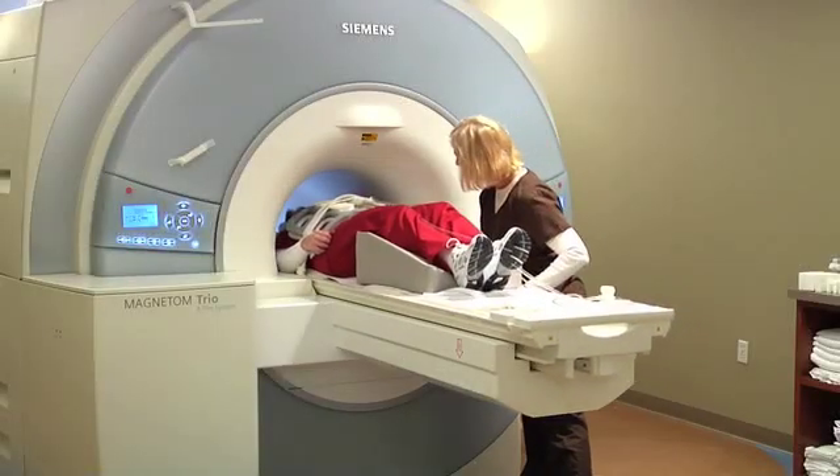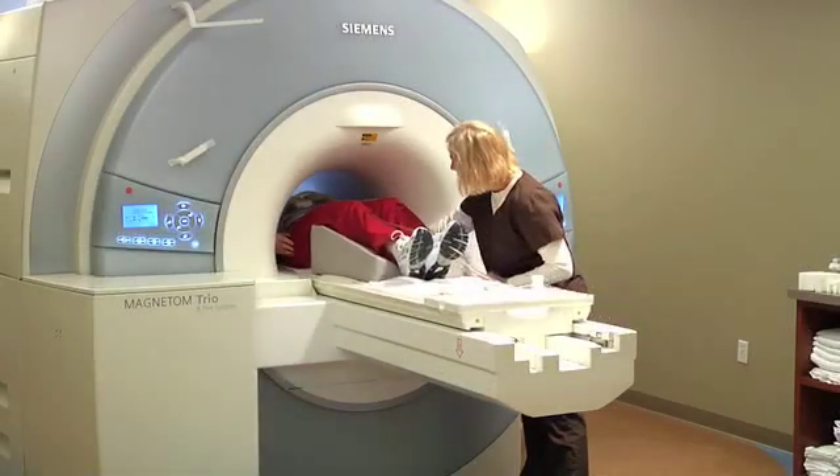Once everything is set, the table will rise and your abdomen will be placed in the center of the machine. Most abdominal MRIs take about a half an hour to complete, and during that time the technologist will be giving you breath hold instructions and keeping you up to date on your progress.